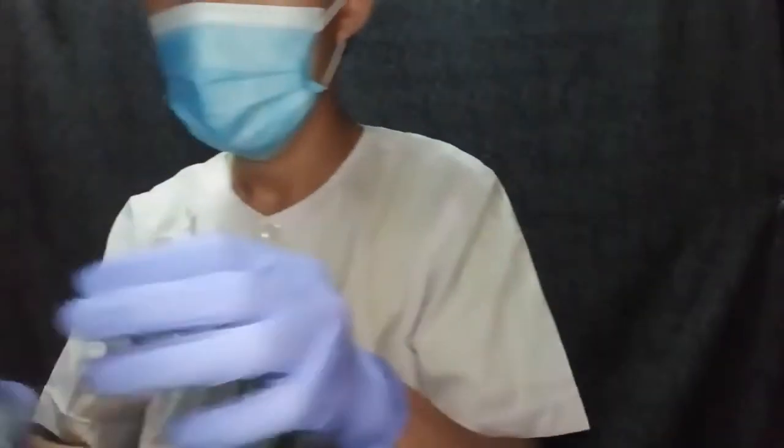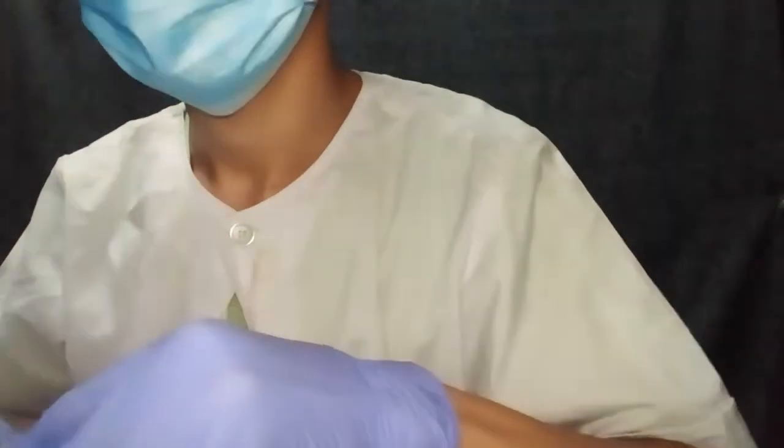Now let's proceed to the post-laboratory exercises. First, discard the used materials. Make sure to put infectious materials in a separate bin. When you are in a medical laboratory, you must put them in a yellow bin. After that, don't forget to clean and disinfect the working area.